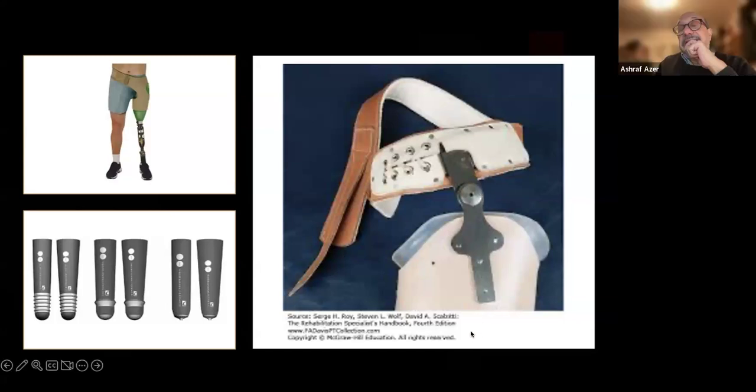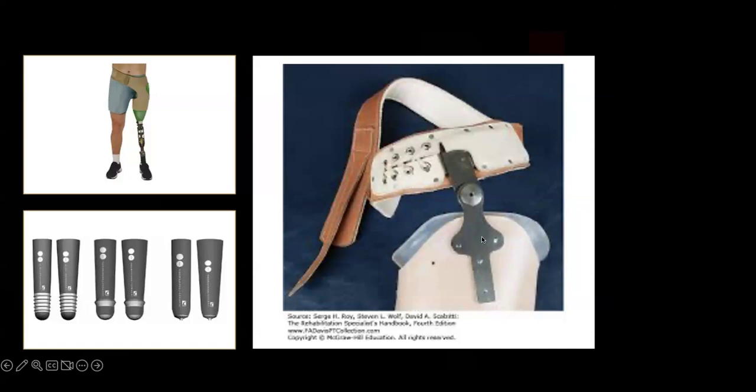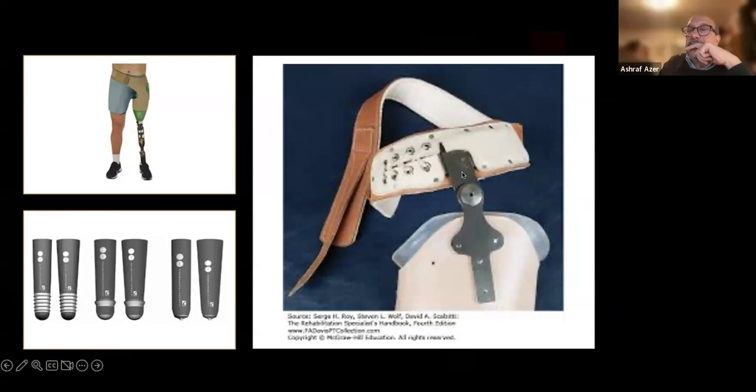No. Rigid. This is the lateral aspect. This is the greater trochanter here. Maybe neuromuscular, meaning there is no enough force. If you don't have enough gluteus medius power in here, that means that this will act as an extra hip joint.